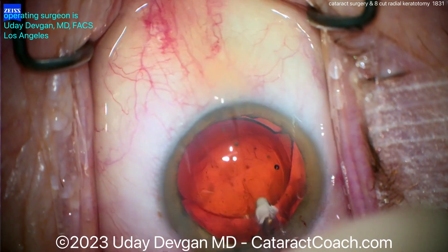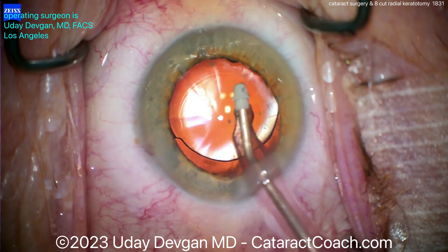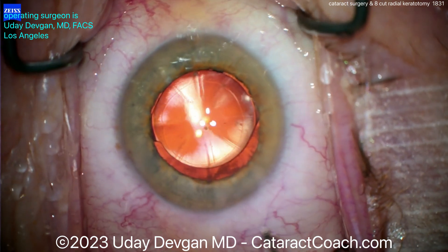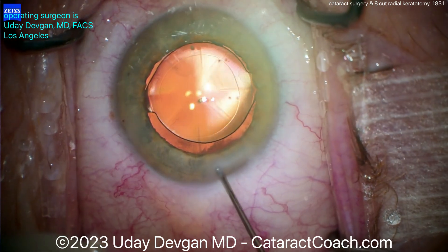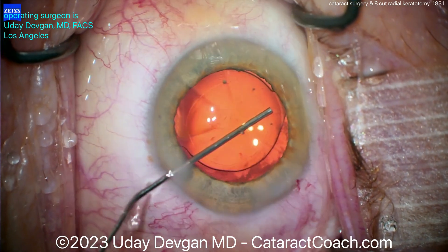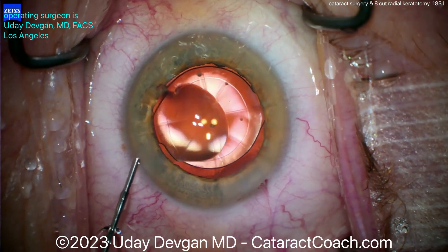Let's go in to remove the viscoelastic. This patient will do very well. Remember, in the post-op period, RK incisions swell — so watch the K value post-op. If this patient is +1.00 or +1.50 tomorrow, I'll be happy, because the cornea is going to be about a diopter to a diopter and a half flatter than it was pre-op due to the RK incisions swelling. At the end, make sure you hydrate just the roof of the incision — do not hydrate toward the sides or you will rip open the RK incisions. A week or two later, when the Ks go back to the pre-op value, you can assess the refractive outcome. In this case it'll be close to emmetropia — a very happy patient.